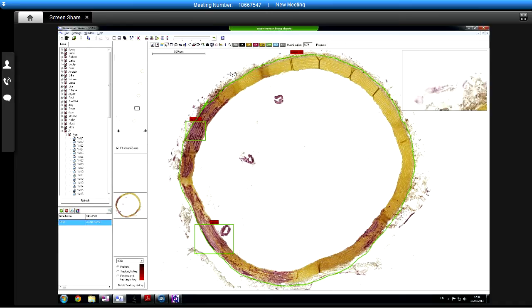If we can get it to reliably identify the yellow, that gives it the same answer, doesn't it? Yeah. That's what it looks like. I'm not convinced that that's actually possible, given that it seems to identify red and yellow as the same thing anyway. But let's just have a try of that. One last go.